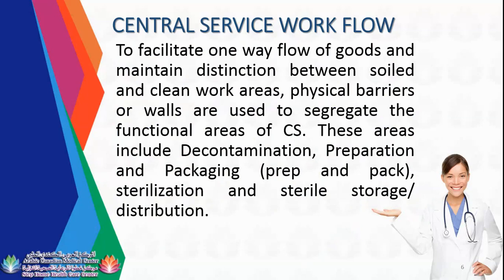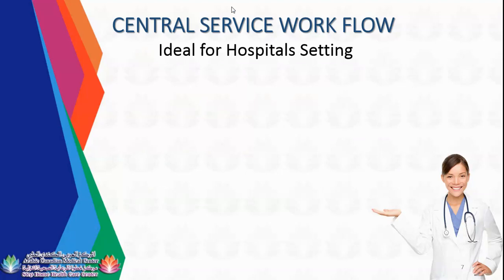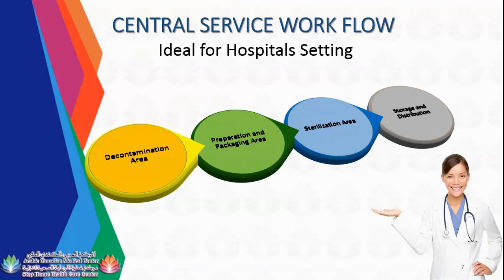So the areas in CSSD include decontamination, preparation and packaging, sterilization, and sterile storage for distribution. As you can see in your slides, there are four areas in CSSD. Actually, this is the ideal setup. The first area is the decontamination area. The second area is the preparation and packaging area. The third area is sterilization, where your autoclave is available for processing the instruments. And the last is storage and distribution.